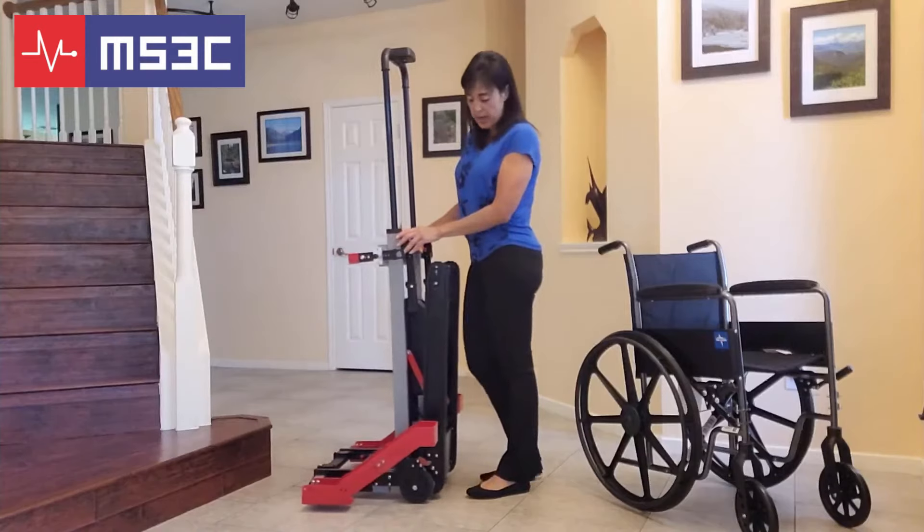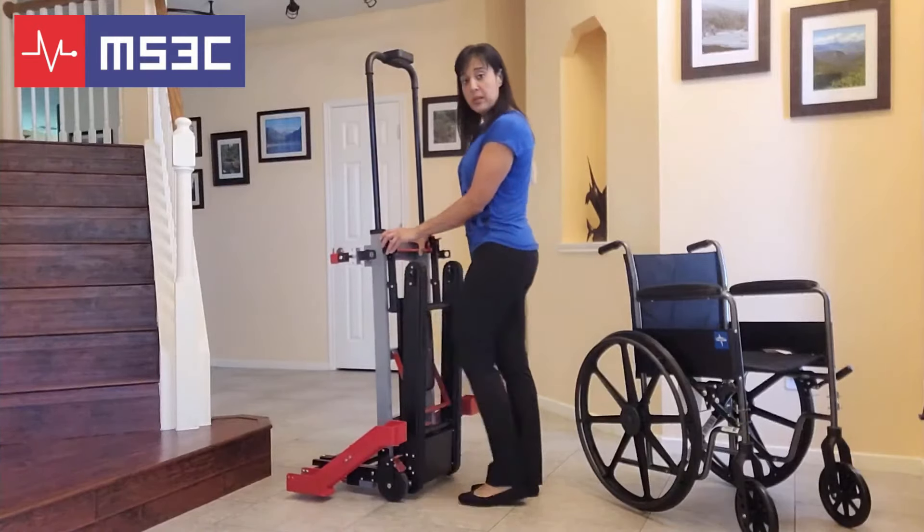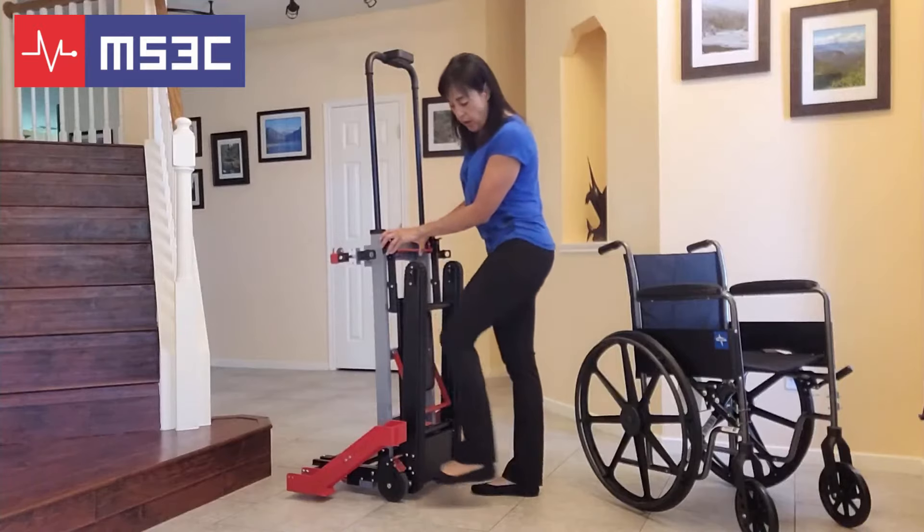This unit comes with locking casters. To lock the caster, push the red on button. To unlock, push the red off button.